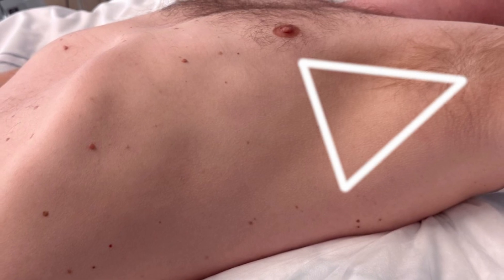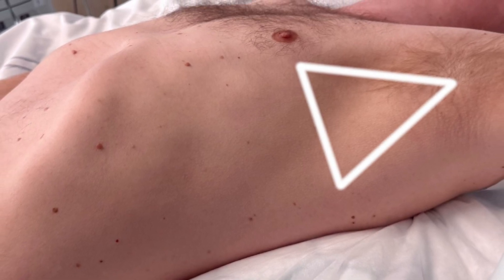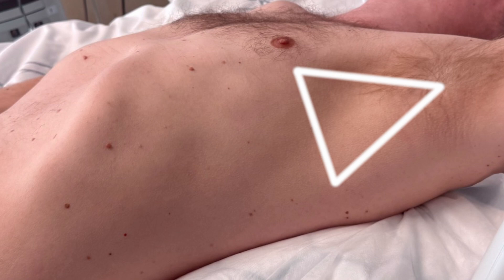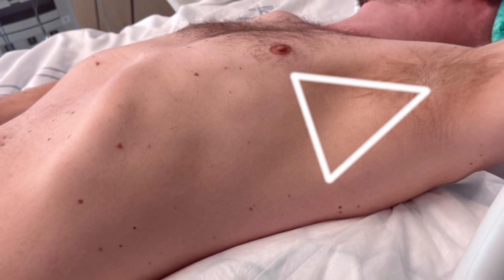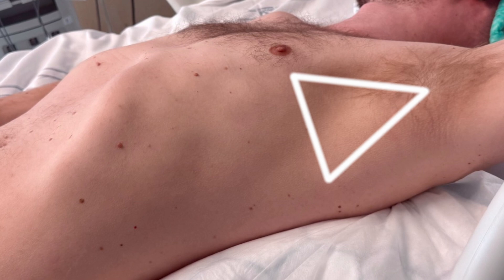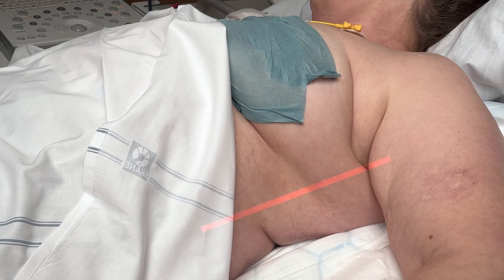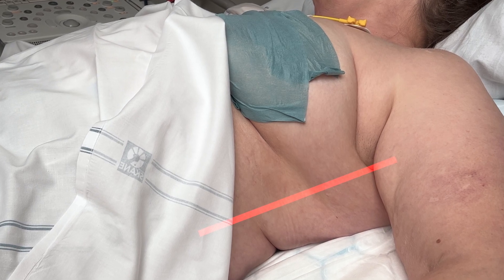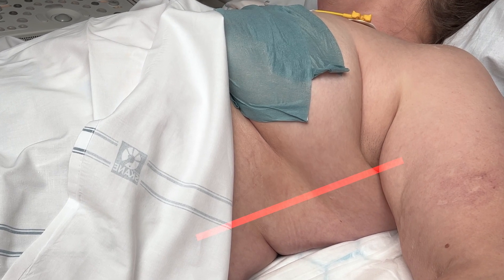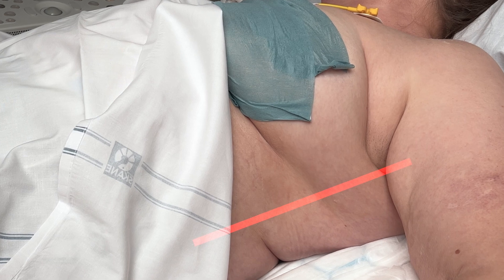The concept of the safe triangle is not a safe way to place a chest tube. Anatomy varies and a blind drain can end up seriously wrong. Your puncture site should be determined with ultrasound always. The puncture site should be ventral to the mid-axillary line for optimal patient comfort, as a patient lying on a dorsal drain will experience pain and may even develop pressure sores.